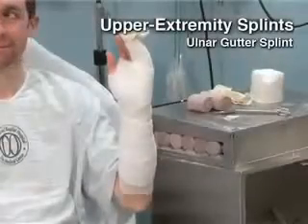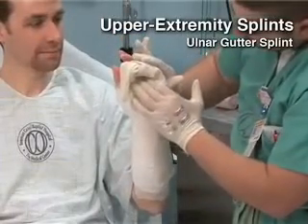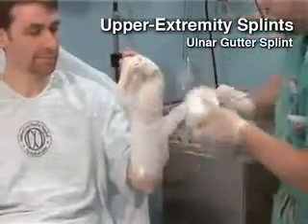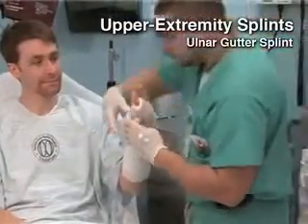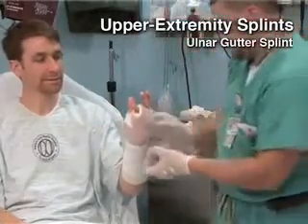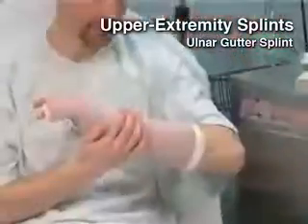Ulnar gutter splints are designed to immobilize fractures along the ulnar aspect of the hand, including injuries to the 4th and 5th phalanges and metacarpals. This splint extends from the distal interphalangeal joint of the little finger to the proximal forearm. Place the forearm in a neutral position with the wrist in 20 degrees of extension. The metacarpal phalangeal joints should be flexed at 50 degrees, with the proximal and distal interphalangeal joints in slight flexion.